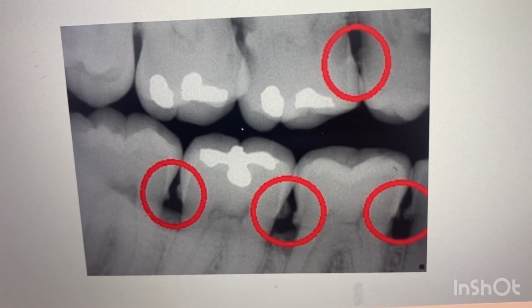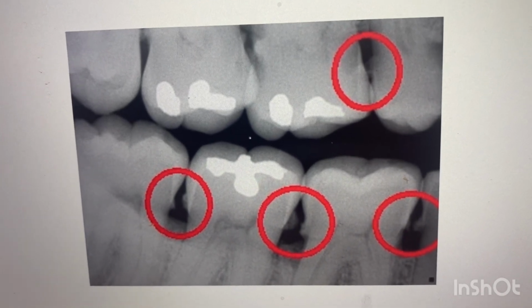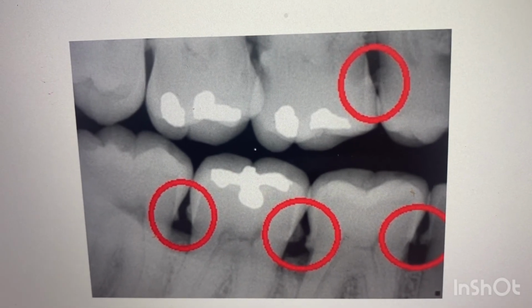It is important to remember that we want to limit strokes with pressure to areas where calculus is present. Our goal is to use the minimum strokes needed to remove these deposits.